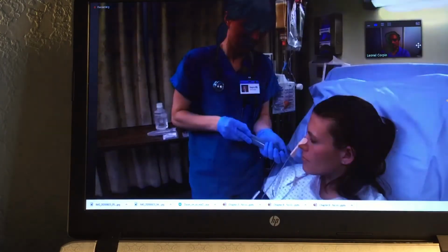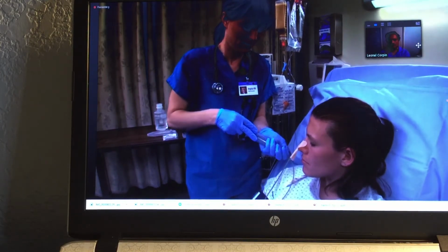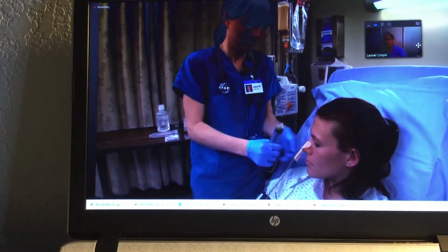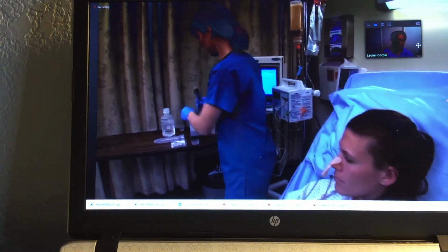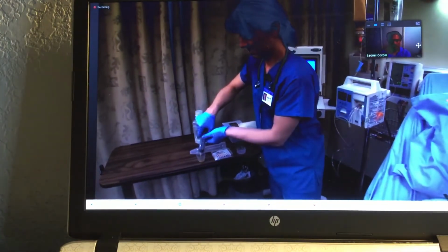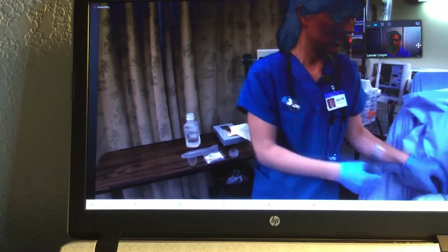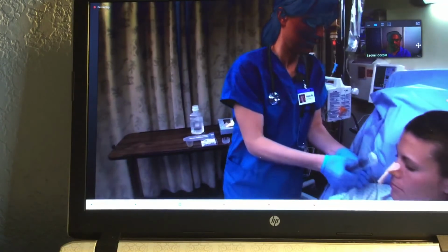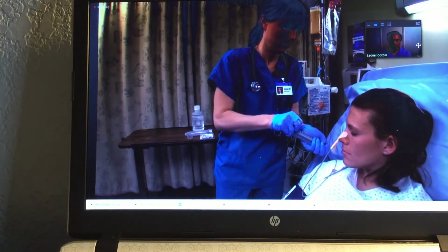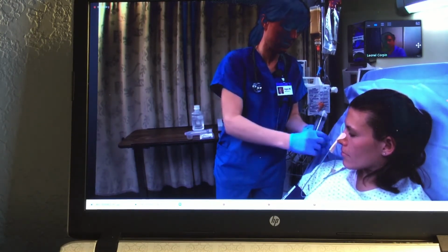Gently pull back on the plunger to aspirate 5 to 10 milliliters of fluid. Assess the appearance of the aspirate and its pH to help confirm placement. Clear the syringe and inject 30 milliliters of air. Test the pH of the fluid you placed in the cup.